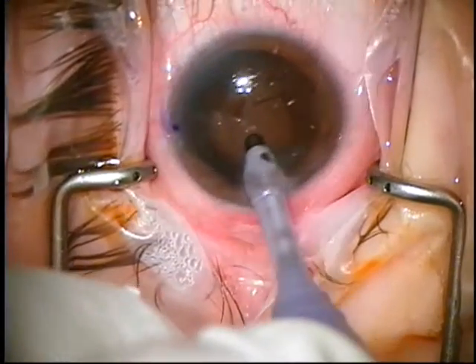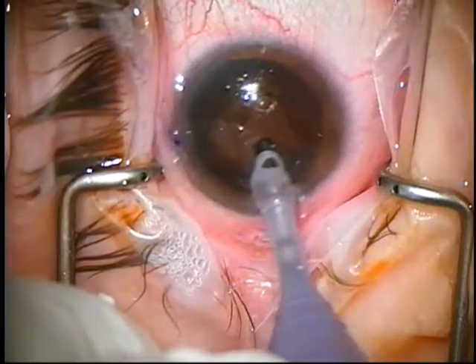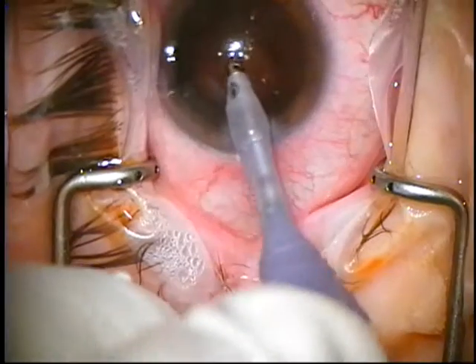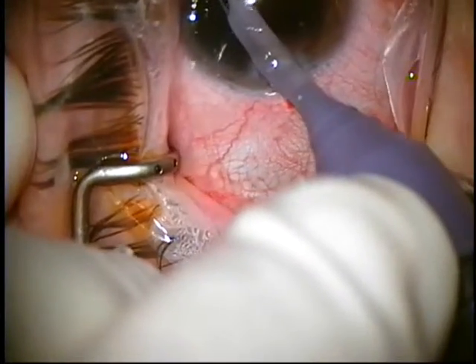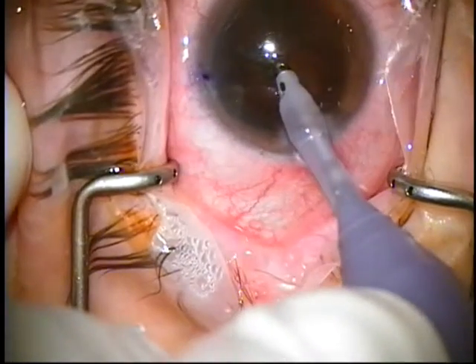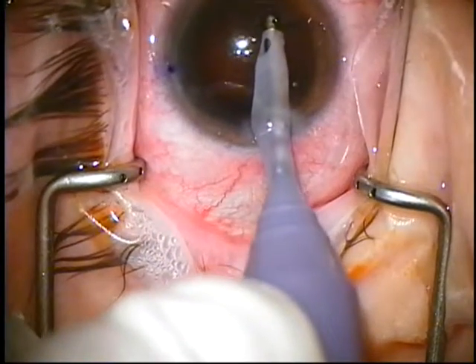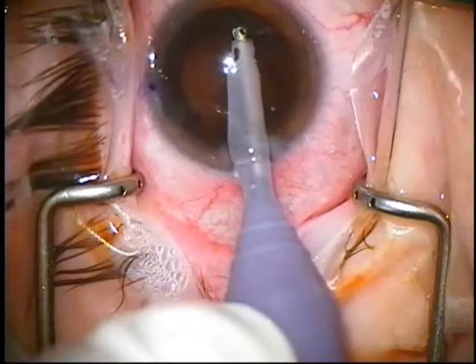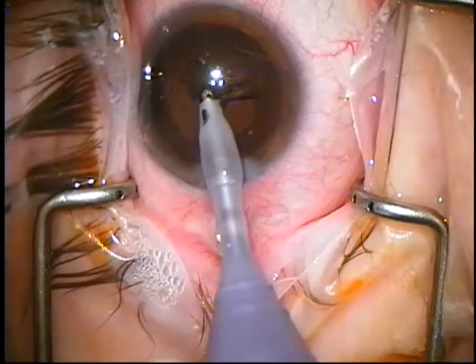Same thing here. Fill my port up. As I come up on my foot, I turn and then pull radially. Fill my port, pull radially. See how that port goes right underneath the anterior capsule — in the middle, not up high. I'm not pushing on the anterior capsule. I have to let the cortex fill the port and pull as I come down on my foot.